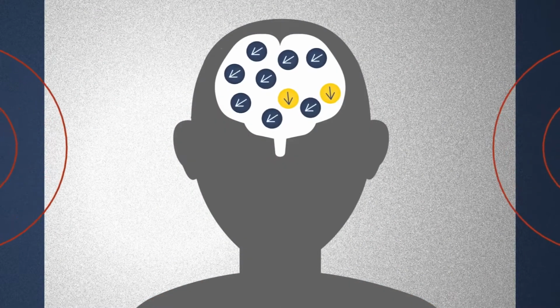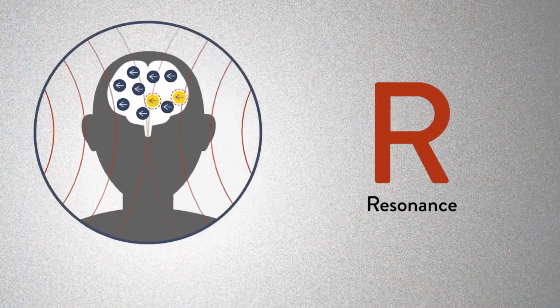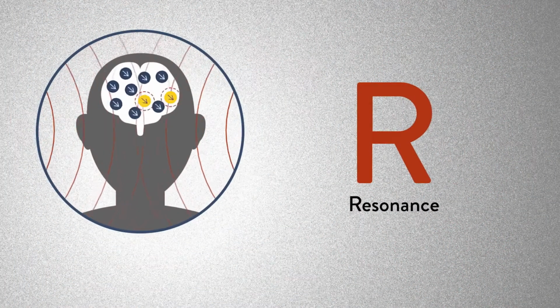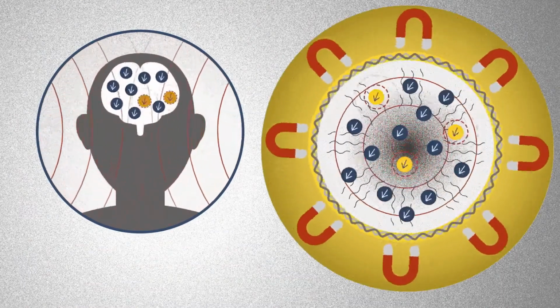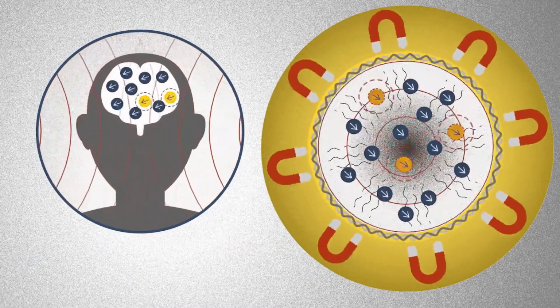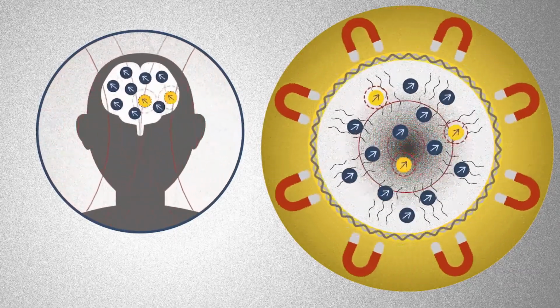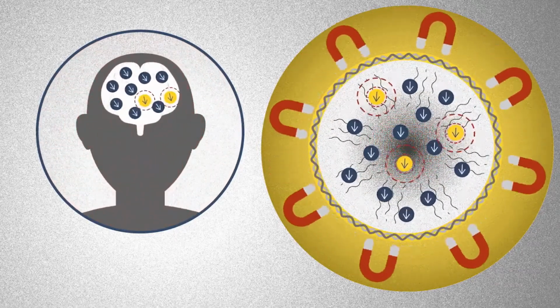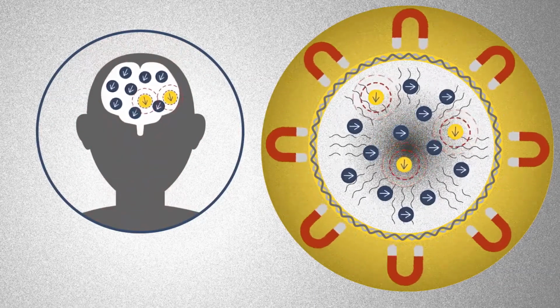The RF electromagnetic field produced in the transmitting coil is a magnetic near field with very little associated changing electric field components, such as all conventional radio wave transmissions have. Thus, the high-powered electromagnetic field produced in the MRI transmitter coil does not produce much electromagnetic radiation at its RF frequency, and the power is confined to the coil space and not radiated as radio waves.